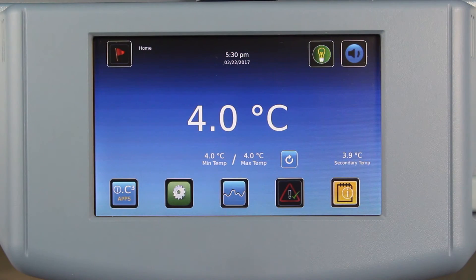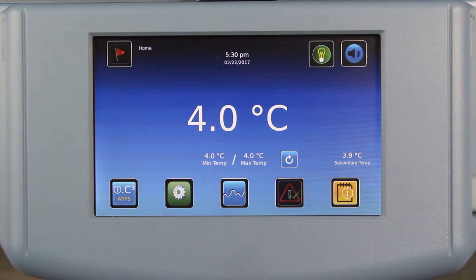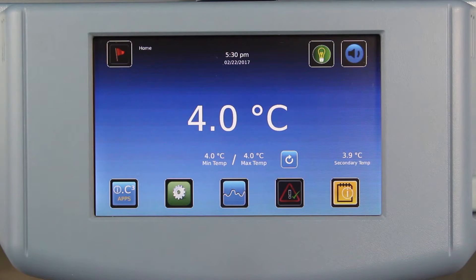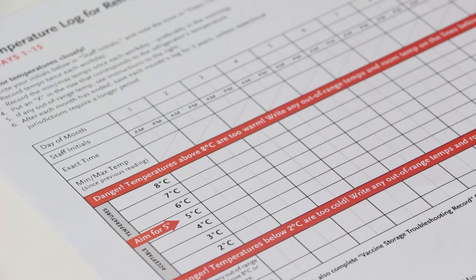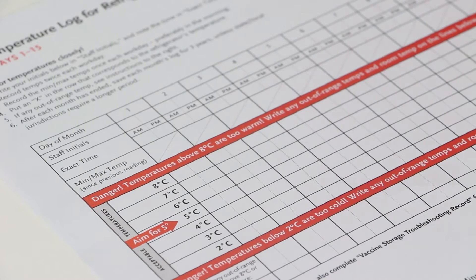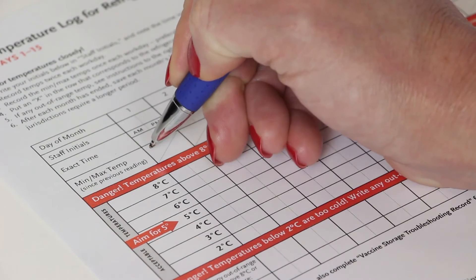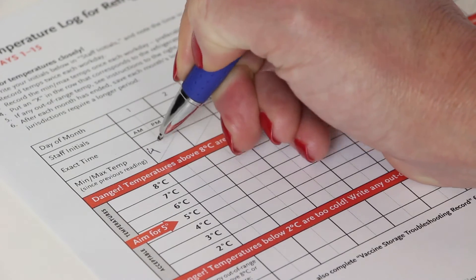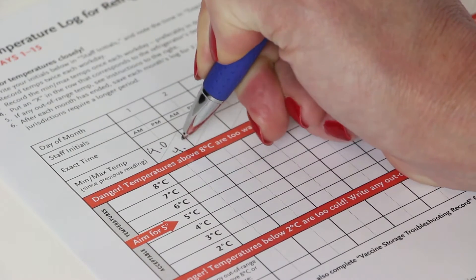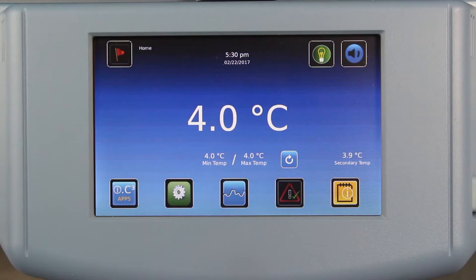First of all, we have added min-max functionality to the IC3. This enables users to view the minimum and maximum recorded temperatures right on the home screen. Some users need to document the minimum and maximum temperatures on a regular basis, especially for vaccine storage applications. The min-max feature makes it easy for them to do this.